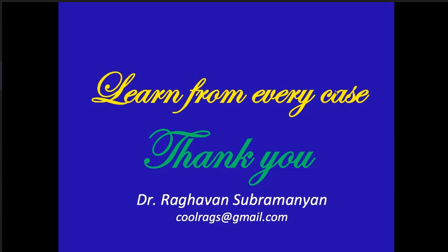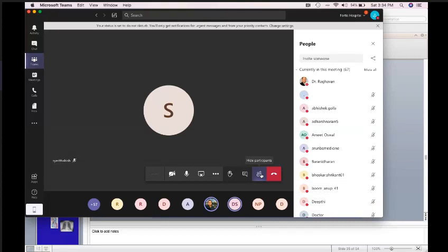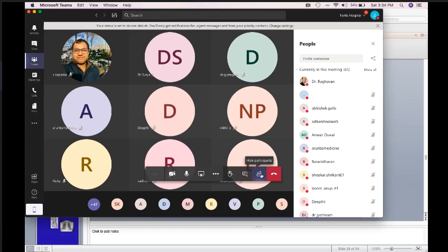Okay. Any other question? Sir, in steep view, will there be more overlap as compared to shallow view, or less overlap? See, the normal heart always overlaps in shallow, and moderate always overlaps. In steep and lateral, we don't get much overlap. Steep overlaps very little and lateral doesn't overlap. So the shallow ones and AP always overlap. If you are considering by overlap, if half of the heart is overlapping, it is shallow. Only one third of the heart overlapping is steep. No overlapping is lateral.